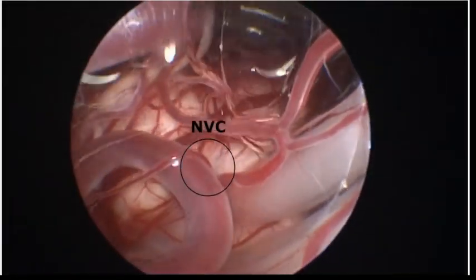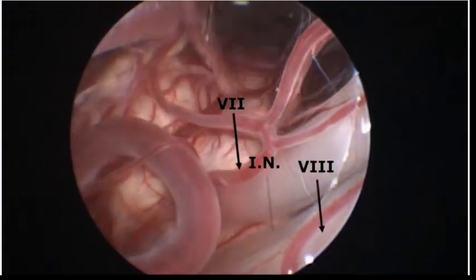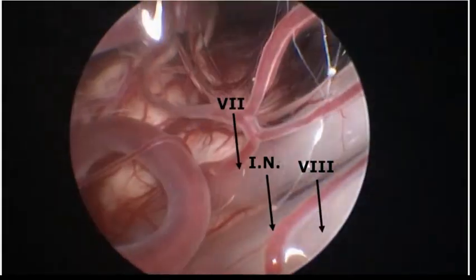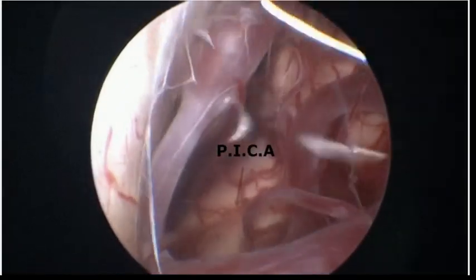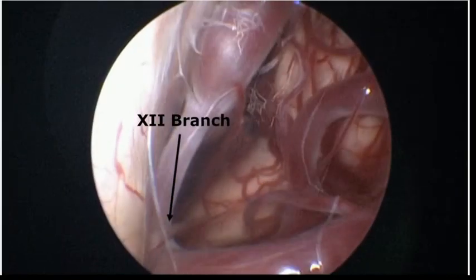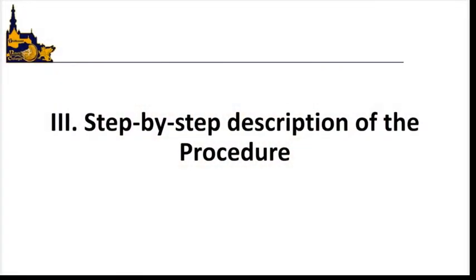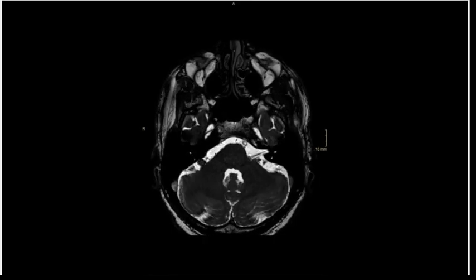The facial nerve passes from the cerebellopontine angle together with the vestibulocochlear nerve and the much thinner parasympathetic branch of the facial nerve, the intermedial nerve, to the internal auditory canal at the skull base. Endoscopically, PICA can be identified by a branch of the hypoglossal nerve crossing the artery in the depth. AICA branches off cranially. In some cases, a combined origin of both vessels can be observed. Relevant compression of the facial nerve is usually found close to the brainstem, the root exit zone.